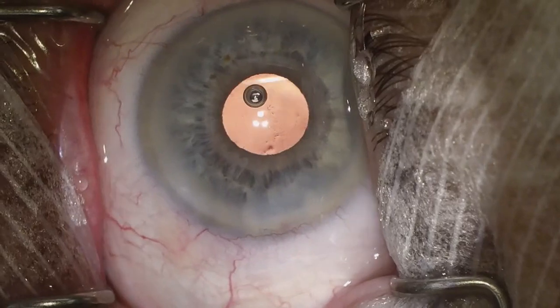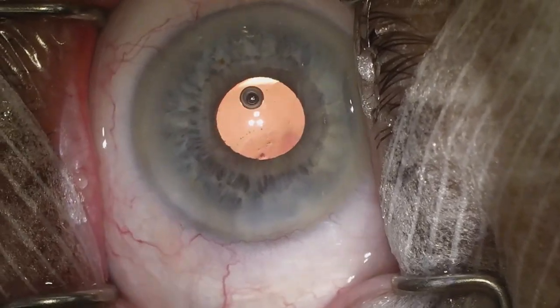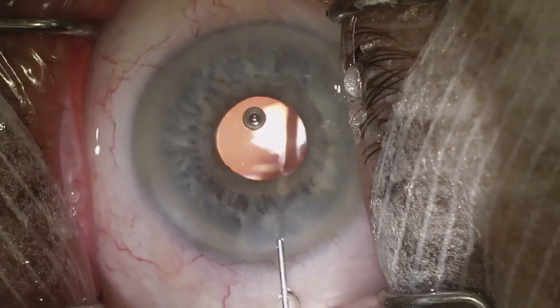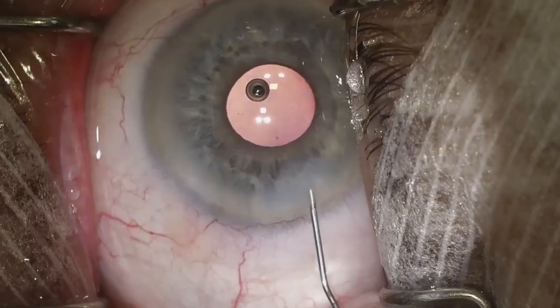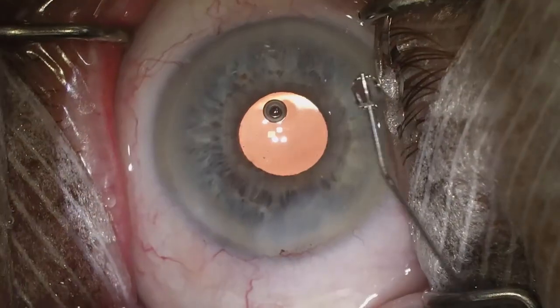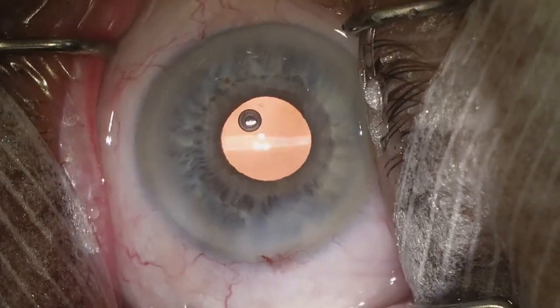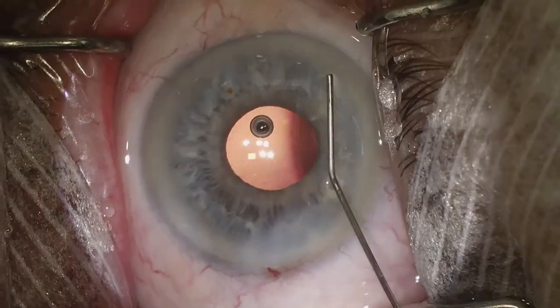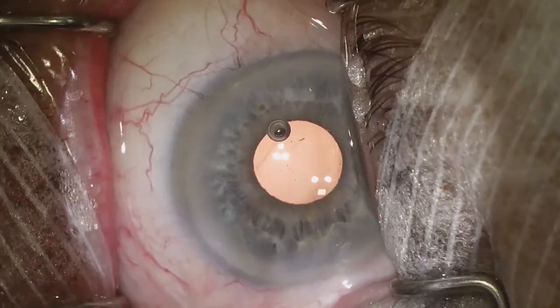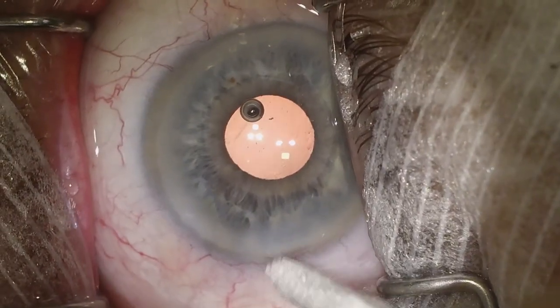It seems a little bit low here, so I'll put some more BSS into the anterior chamber. Still a little bit low — we may have a leak at the main wound, so we'll go ahead and hydrate the main wound again. After doing that it seems a little bit firmer. Now it is nice and firm — not too soft, not too firm. We'll check the wounds and make sure they're nice and watertight.